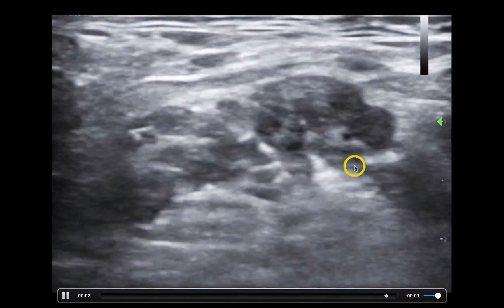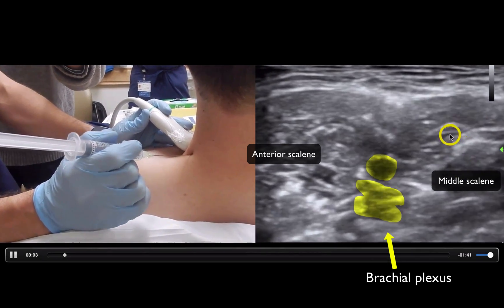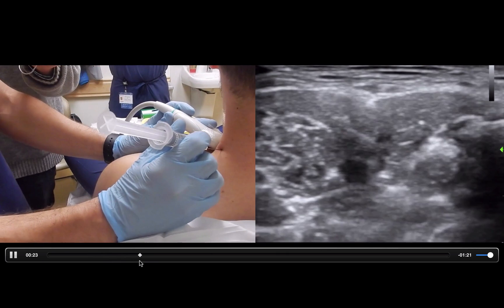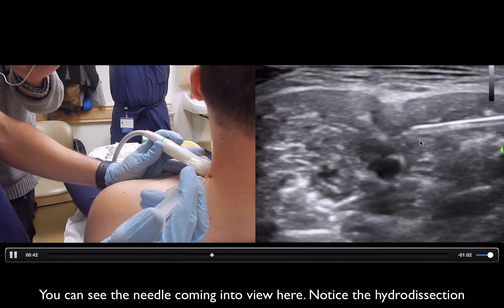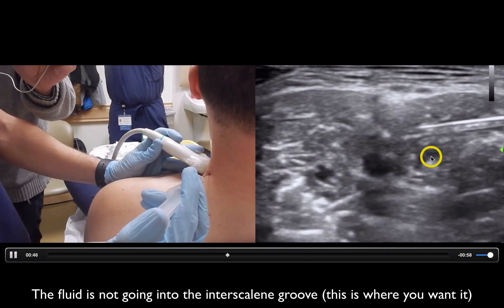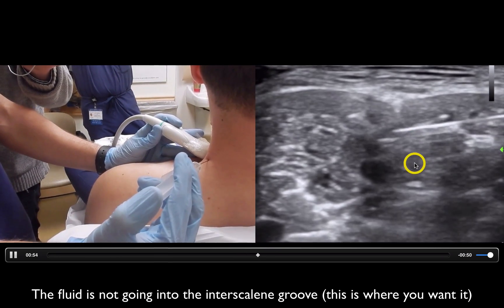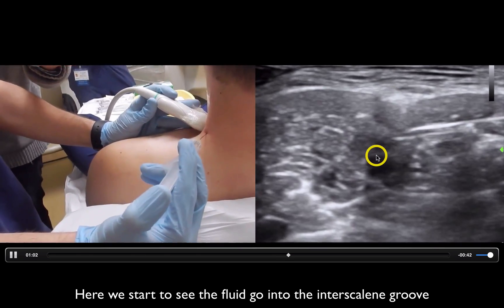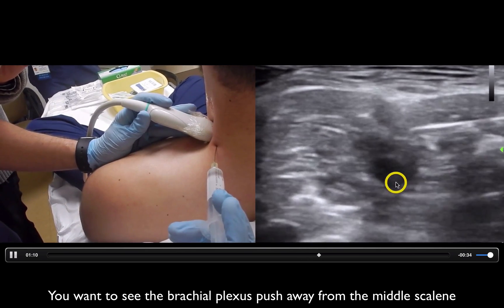Right here is the anterior scalene, there is the brachial plexus — kind of looks like stoplights — and here is the middle scalene. When I was a fellow, I had Matt Dawson, my fellowship director, do these blocks on me because I wanted to know if they were painful. There's my brachial plexus in yellow, middle scalene and anterior scalene. You'll see the needle come in. Matt is going to push a little fluid — hydrodissection — to see where we're at. The fluid is going into the muscle belly, not the interscalene groove, so he pushes further. Eventually you'll see fluid creeping in between the brachial plexus and the middle scalene, pushing the middle scalene away — that's what you want to see.